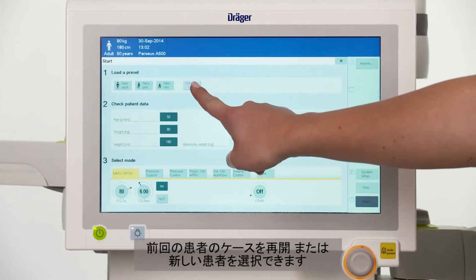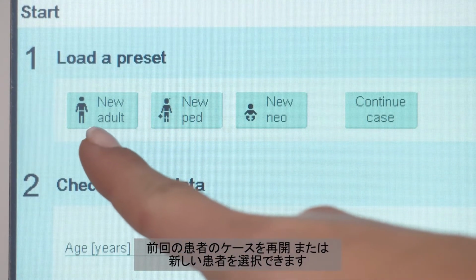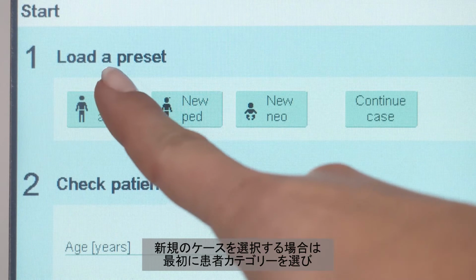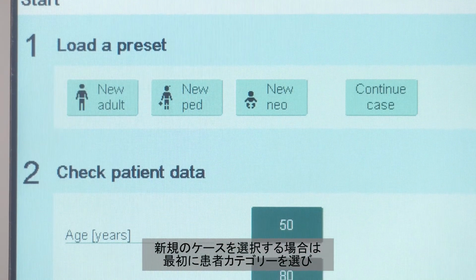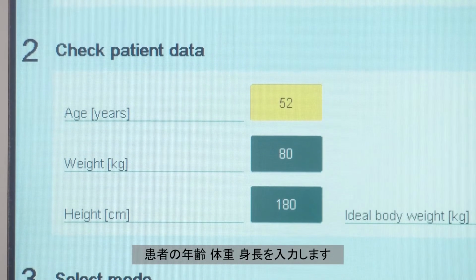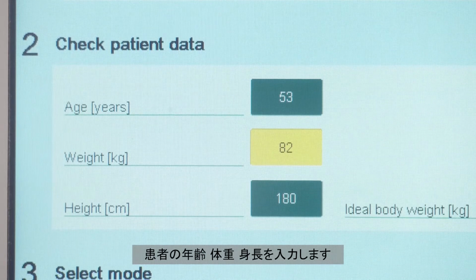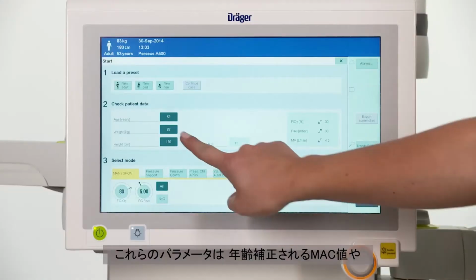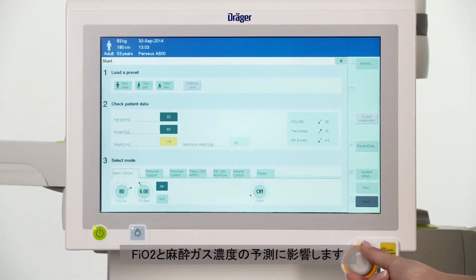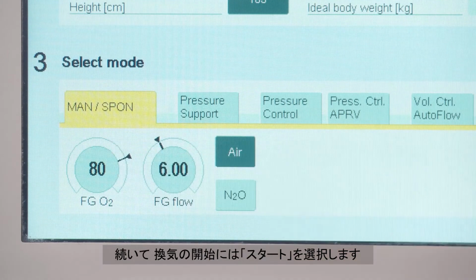You have the choice between resuming a previous case and defining a new patient here. For a new case, choose the patient category first. Then enter the age, weight and height of the patient. These parameters have an effect on the age-corrected MAC value as well as on the prediction of the FiO2 and anaesthetic gas volumes. After that, select the Start mode for ventilation.